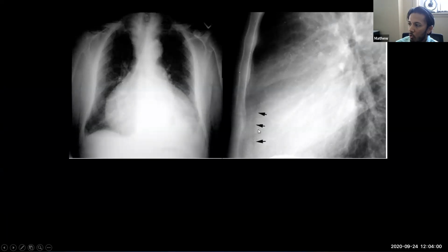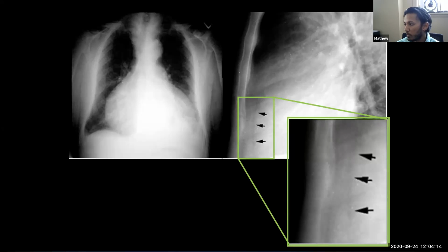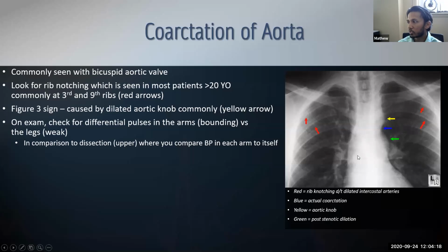They sometimes call it the Oreo sign. You have what's kind of like a reverse Oreo, but I guess if you're using this as the white and then this is black and then this is black, maybe that's the Oreo. But that's the sign that you would look for in someone that has a pericardial effusion or a tamponade. So if you just zoom in, you'll see that it's very clear that there's that fluid showing up there in the x-ray.